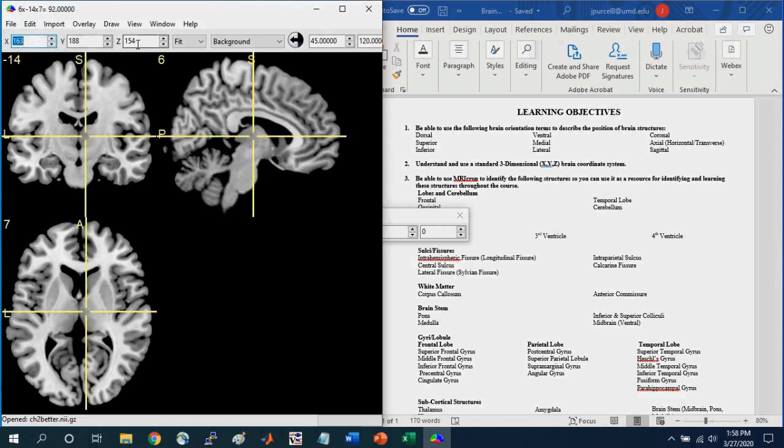So the MNI coordinate system is in millimeter space. But the brain file itself might be in half millimeter space. So these coordinates up here will match whatever the coordinates are for the actual brain file.